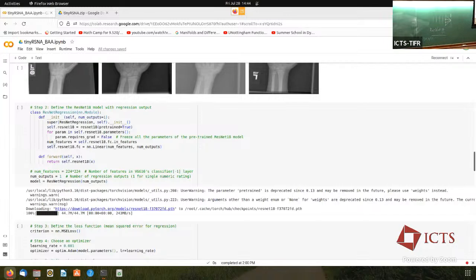Now there's a nuance around this as well. You can freeze the weights of the previous layers and only allow these weights to change. That's one way to do things. Why would you want to do this? What could be a case setting where all the weights from here to here are frozen, which means during the gradient descent process, they cannot change, and you allow only for these weights to change? Why would you want to do that?